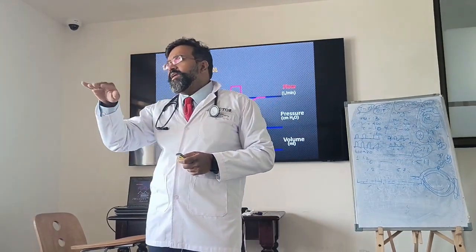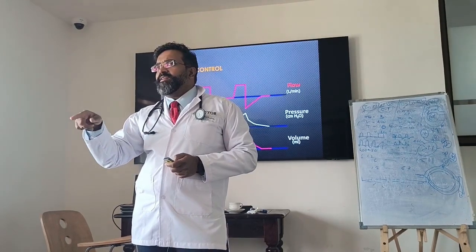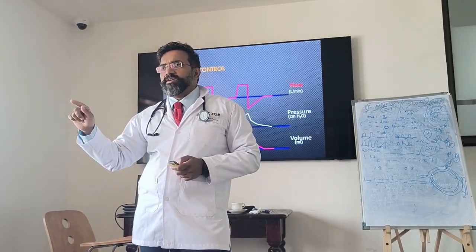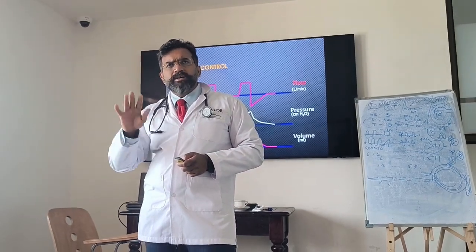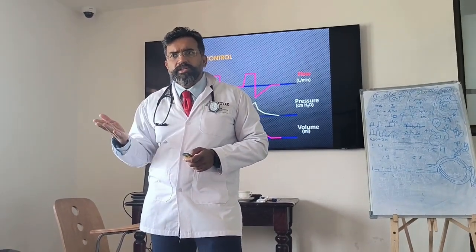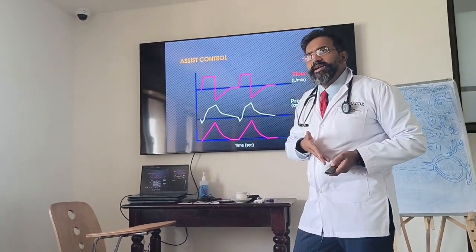So when you are writing your notes on volume control, patient breath set at 10, however patient taking so much frequency, that should come there. अगर तुमने सेट किया 12 और तुम 24 ले रहे हो, there is something wrong or it doesn't require the ventilator, something is wrong, ना there. You're understanding? हाँ? समझ में? Or you have not set the right ventilator.